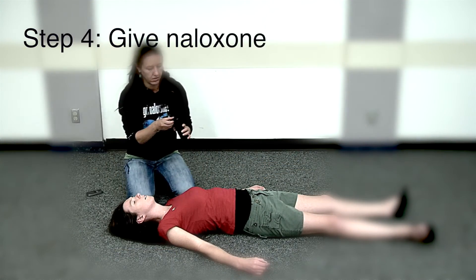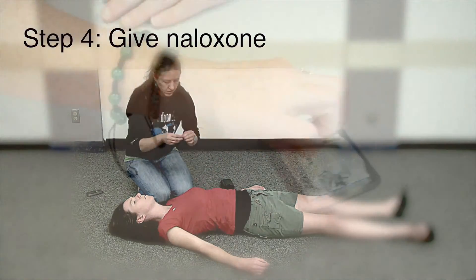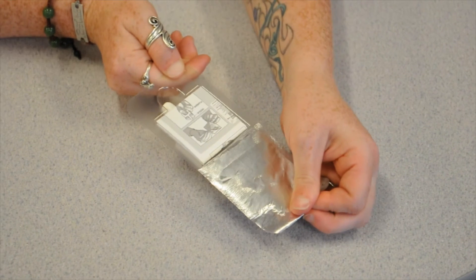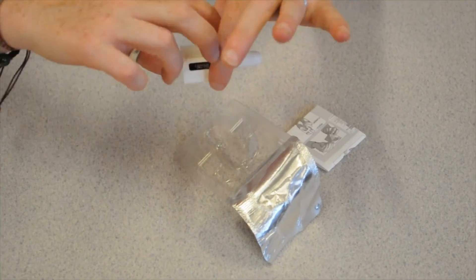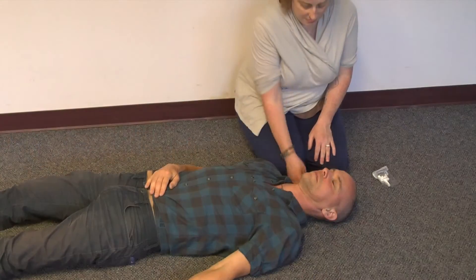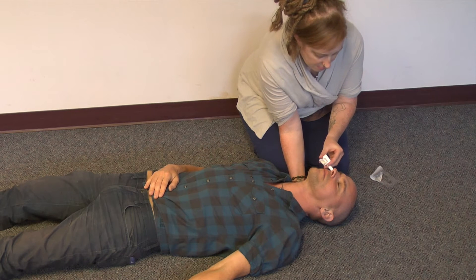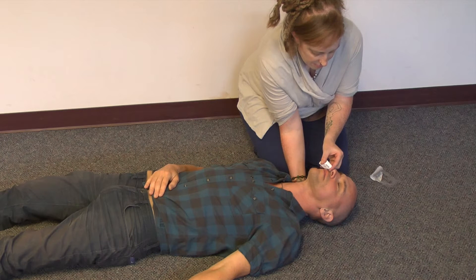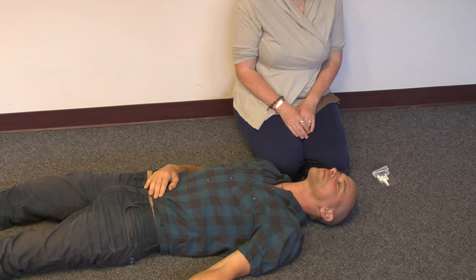Step 4: Give Naloxone. If the person is still not breathing, it is time to use your Naloxone. Peel back the tab with the circle to open the nasal spray. Hold the Naloxone spray with your thumb on the bottom of the plunger and your first and middle fingers on either side of the nozzle. Tilt the person's head back and support their neck with your hand. Gently insert the tip of the nozzle into either nostril until your fingers are against the bottom of the person's nose. Press the plunger firmly to spray the entire dose of Naloxone into one nostril, then remove it.